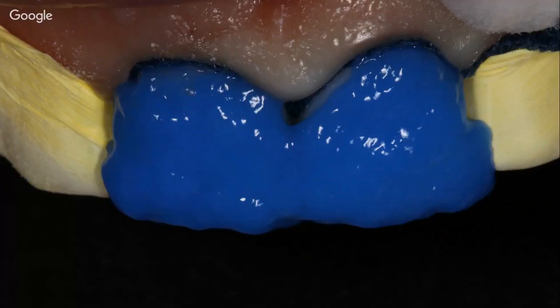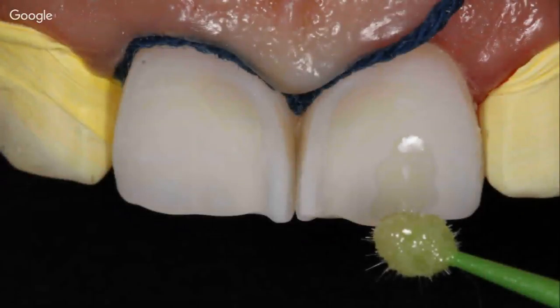remove it after that. You know, another really beautiful picture that I love to show. For those of you who are interested in bonding, that's how bonding should be performed. The adhesive should be placed on a really dull surface. And after it's placed, you have to see that the spot on which it's applied is really shining. And again, it's very difficult for a person to observe this phenomenon if he's not working under magnification.